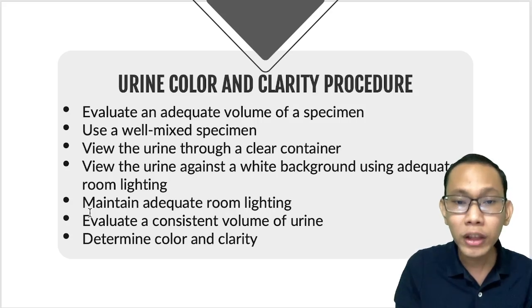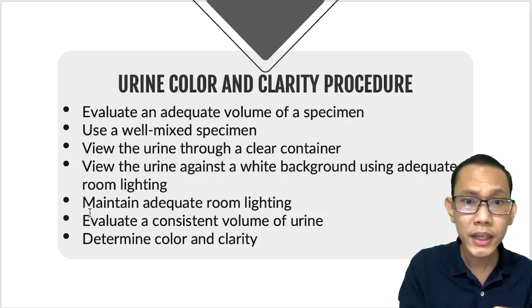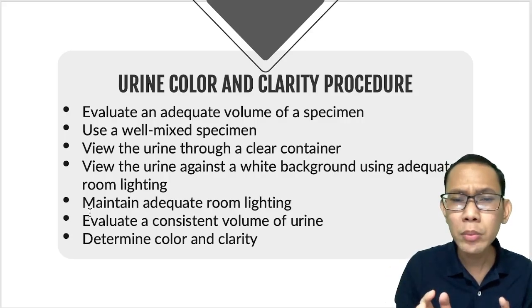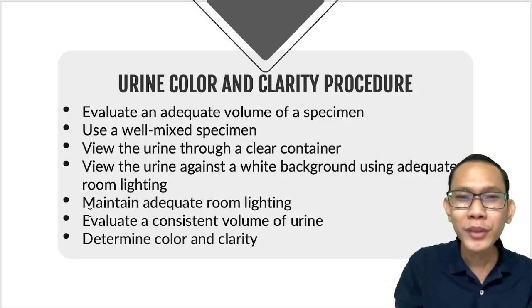Because guys, a lot of times if the result is very incongruent, most of the time the physician will really call the laboratory. I've experienced that a lot of times when I was working. They really ask na, bakit ganito ang result sa physical exam and sa microscopic, parang di siya tugma. So most of the time, pag hindi nagkakatugma, of course, you have to collect another sample and repeat the examination to make sure that the result will become congruent. So that's why, to avoid such problem later on, and of course, para at least hindi kayo pagalitan, you have to really make sure physical exam pa lang, correct na ating sample.